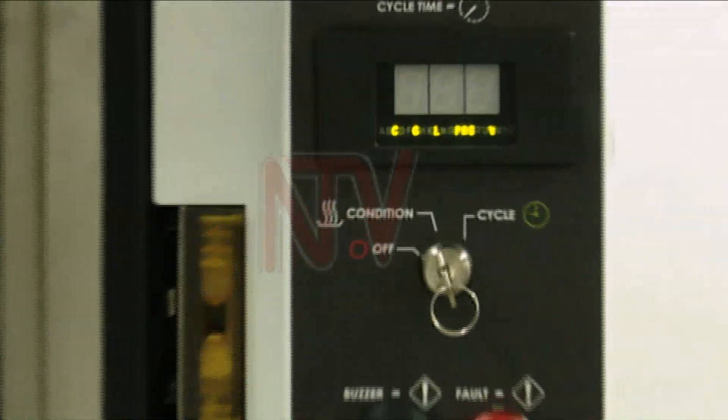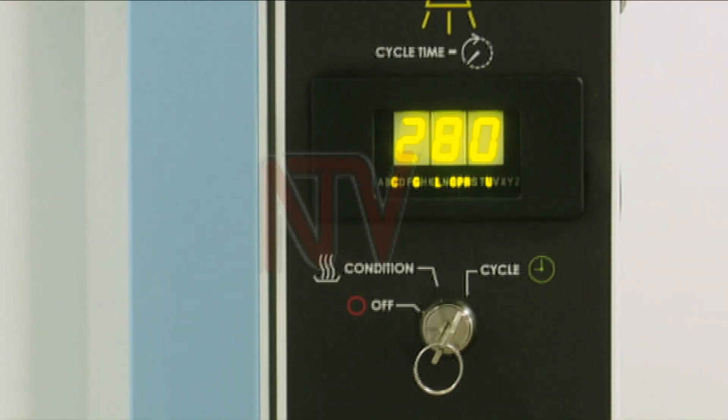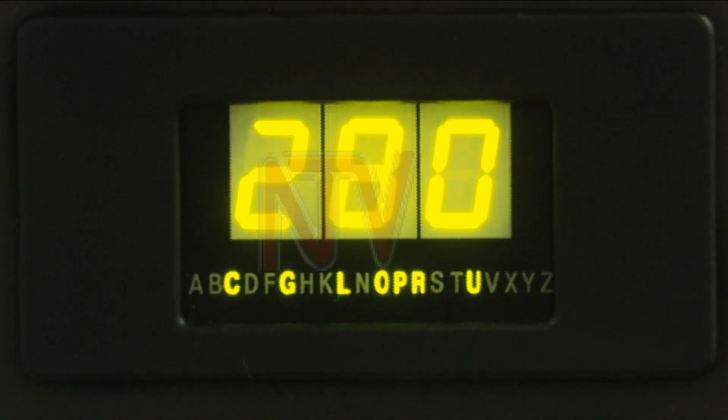The experts are hoping that with the machine in place, it will help reverse deaths linked to blood transfusion complications. Benjamin Jumbe, NTV Weekend Edition.